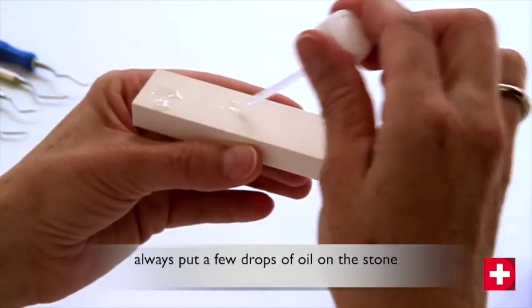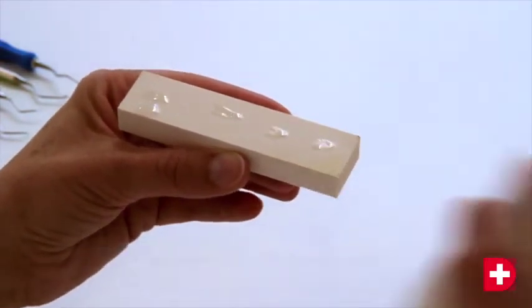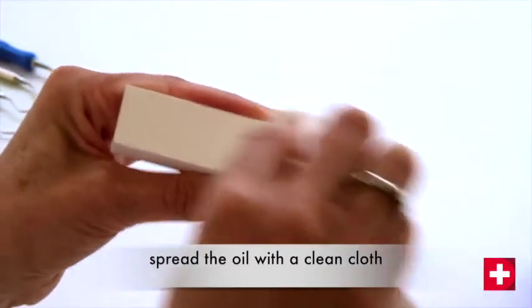Start by putting a few drops of oil on your stone and spread it around using a clean cloth. This simple action ensures optimal surface finish for your blades.